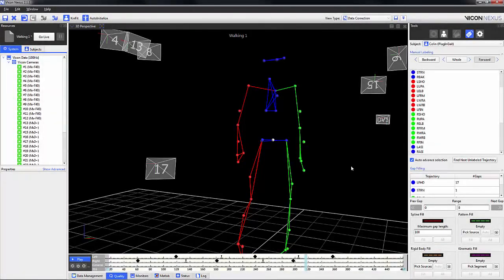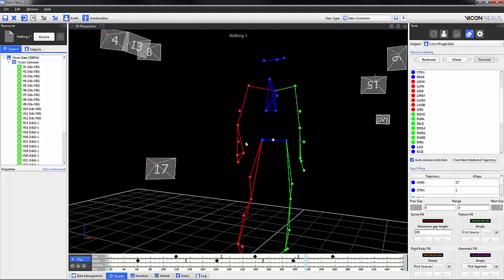In order to see whether markers are correctly labeled, you can hover your mouse over the marker, or you can press CTRL and the space bar to see the names of all of the markers.